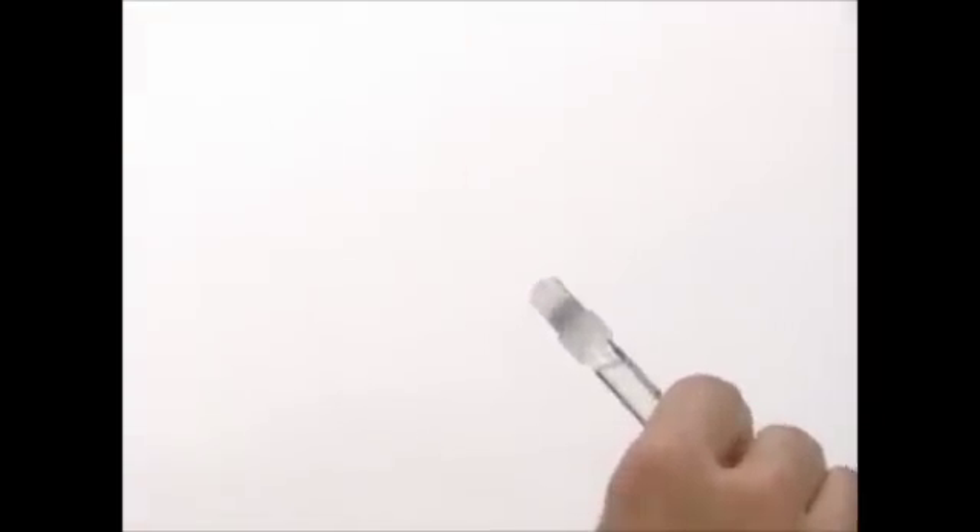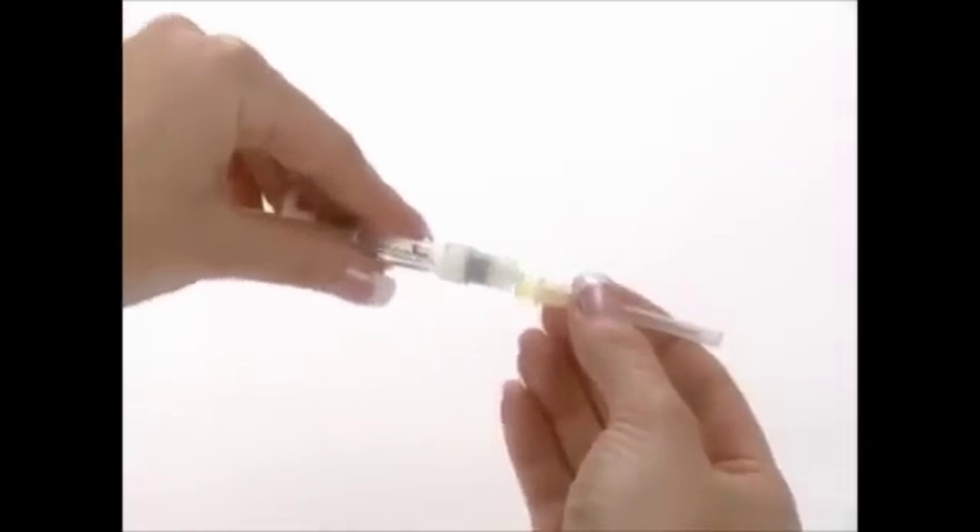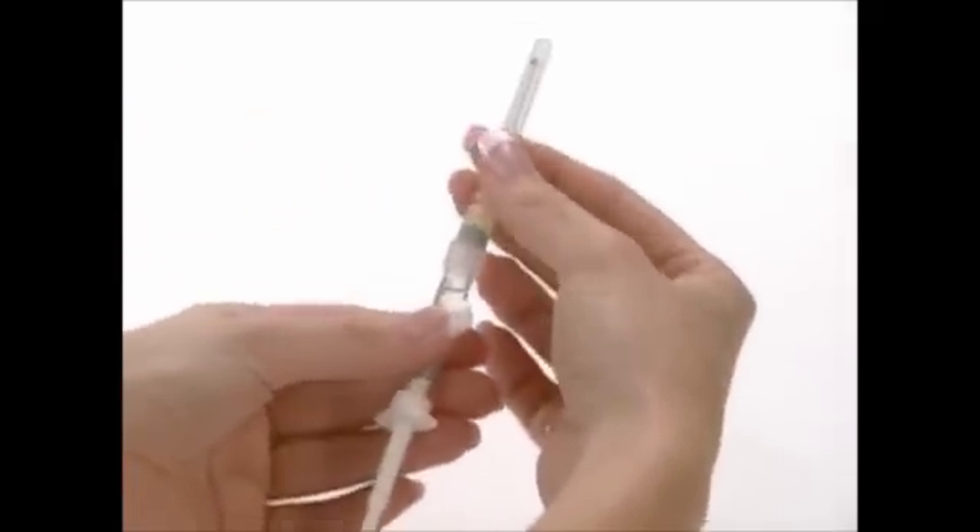Remove the wrapping from the yellow mixing needle, 20 gauge, one and a half inch. Take the pre-filled syringe and remove the cover. Twist the mixing needle, 20 gauge one and a half inch, onto the syringe and remove the cover of the needle.